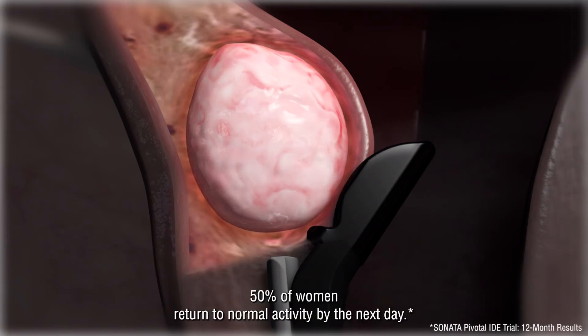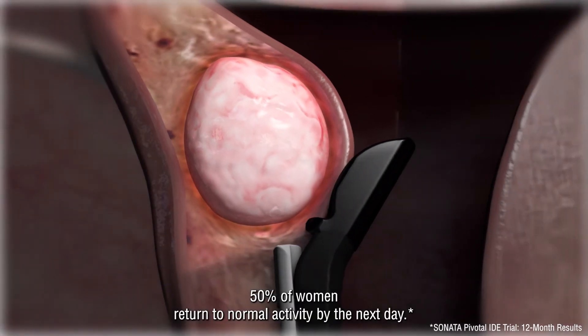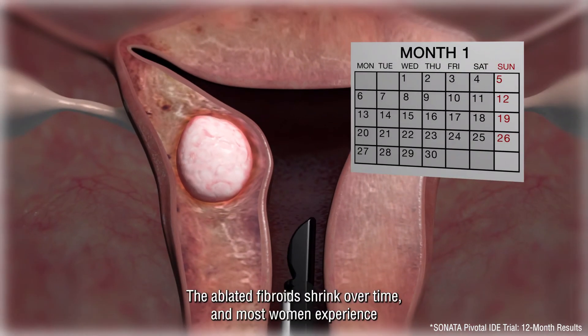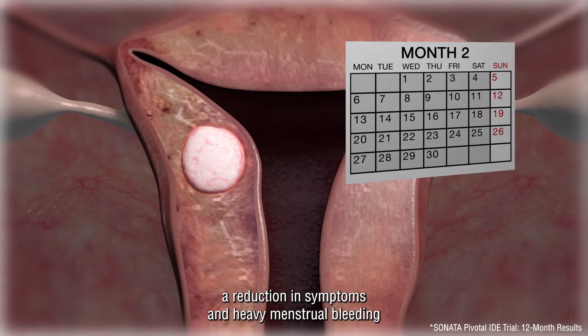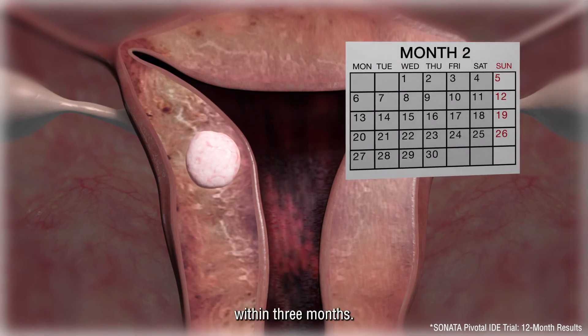50% of women return to normal activity by the next day. The ablated fibroids shrink over time and most women experience a reduction in symptoms and heavy menstrual bleeding within three months.